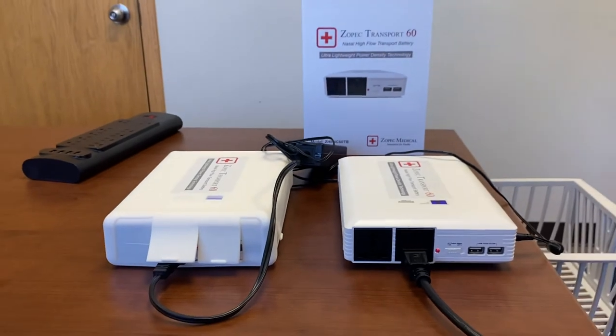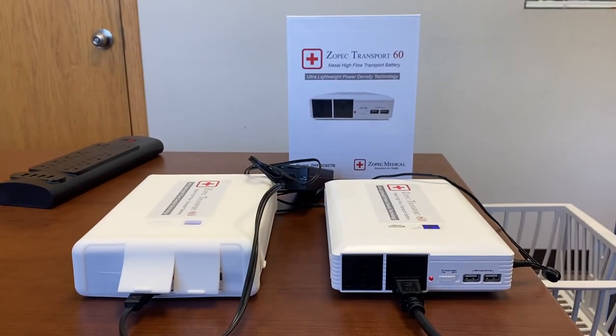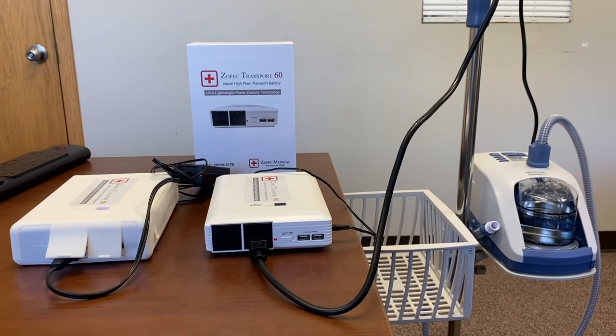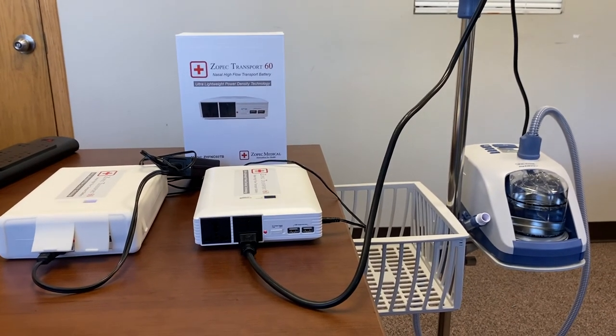That's the ZOPEC Transport 60 battery. If you have any questions please contact us at ZOPEC.com — that's Z-O-P-E-C dot com — and we'll be happy to help you. Thank you very much.